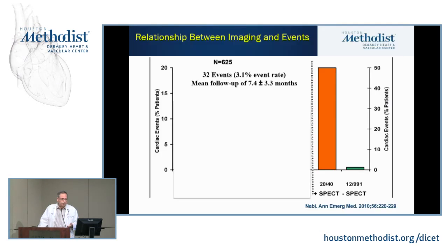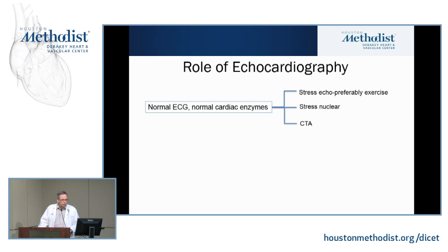And this is where perhaps also echo may be of some help. So the role of echo in this setting really is stress echo. I mean, that truly is the real role. And we had a whole hour on stress echo a few weeks ago, so I'm not going to go through all of that, but it's the same as what we described, right? Stress echo is a very powerful tool. We can detect ischemia, we can look at abnormalities at rest that point out previous injuries, and so on.